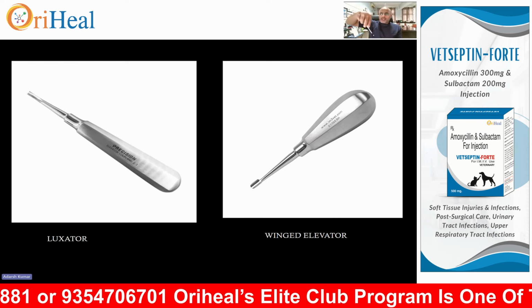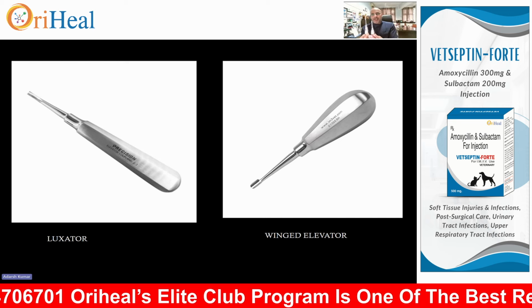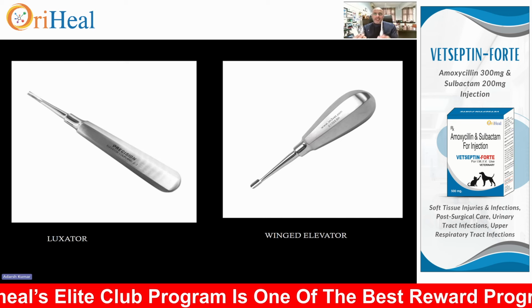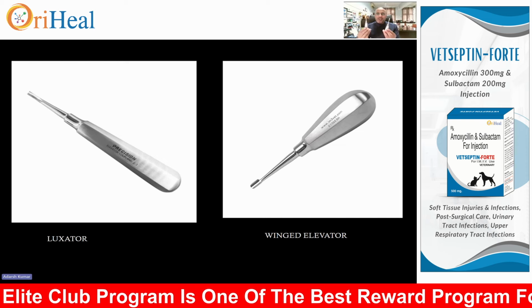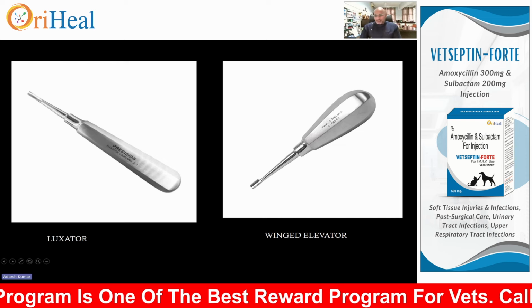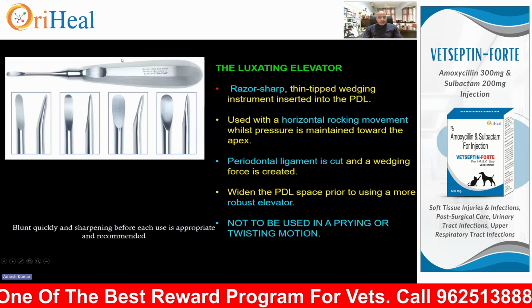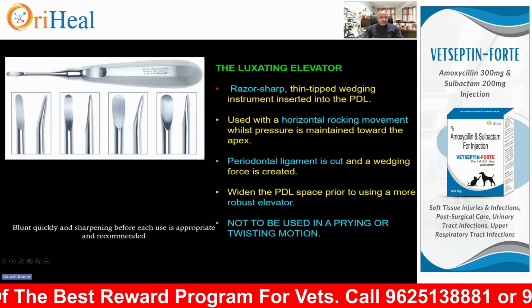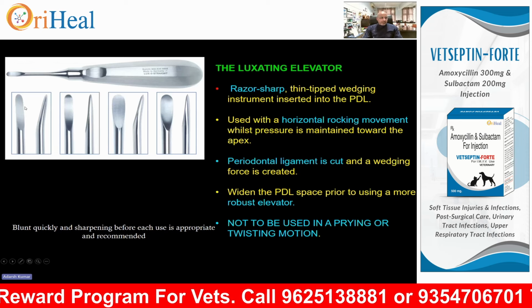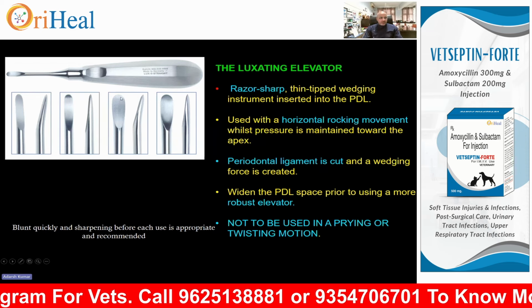Okay, so do not confuse the luxator and the elevators. Many books say this is a luxating elevator and this is an elevator. So just remember that this is the luxator and this is the elevator. So the luxating elevators, or luxators, have this much of a grip. You can see here, sharp, right? Sharp here. So they can go inside.